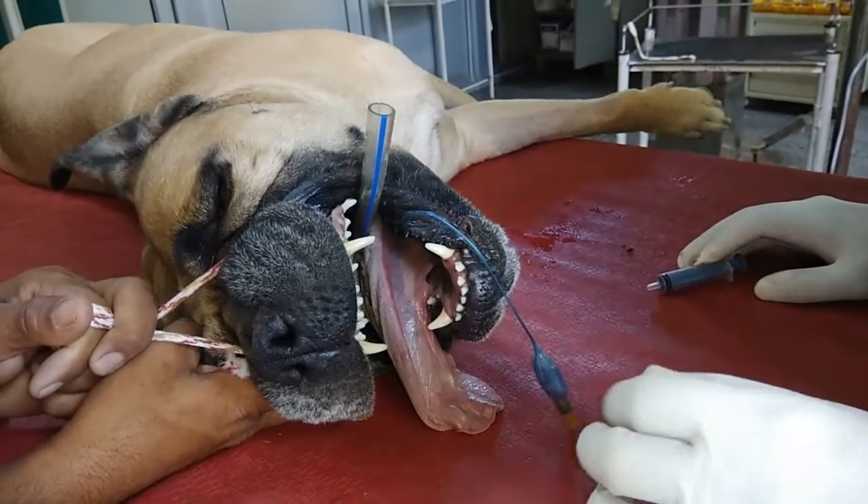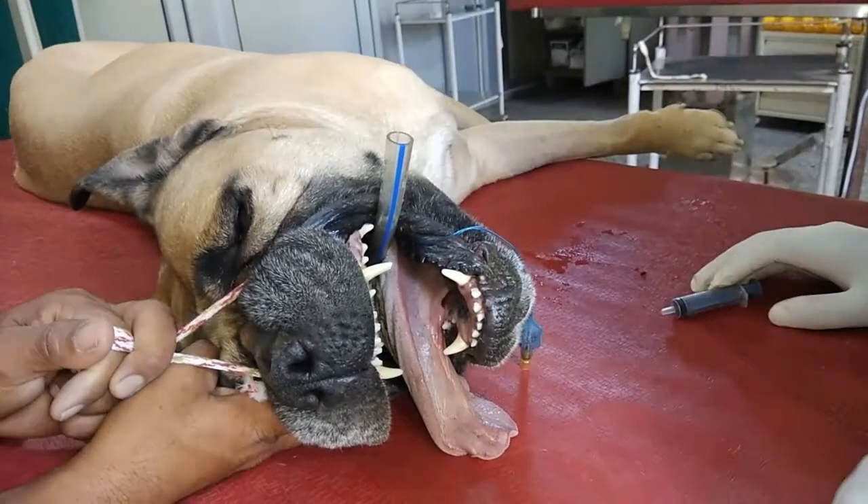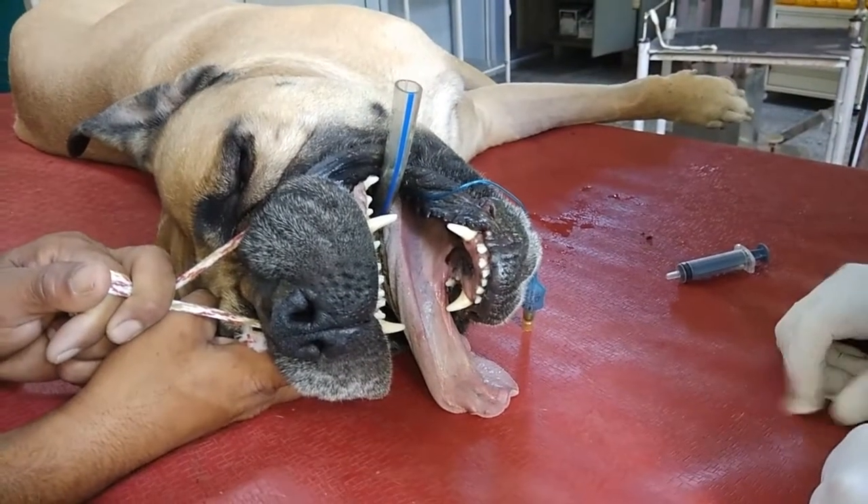This is how we intubate with an endotracheal tube in an anesthetized dog. Thank you very much.